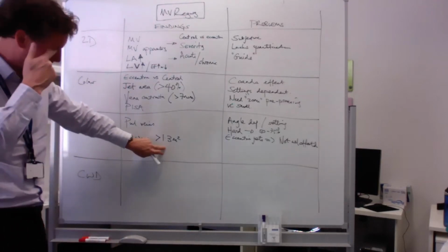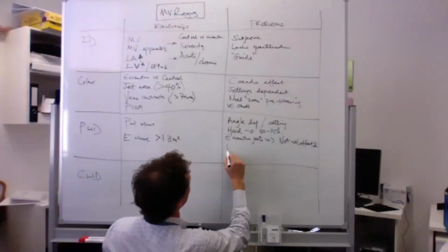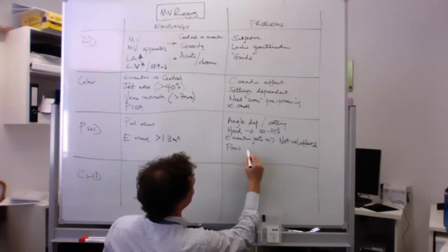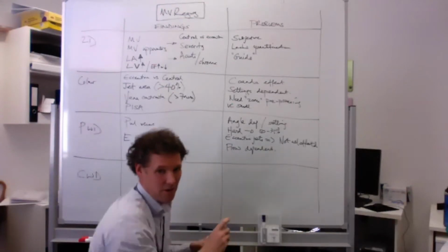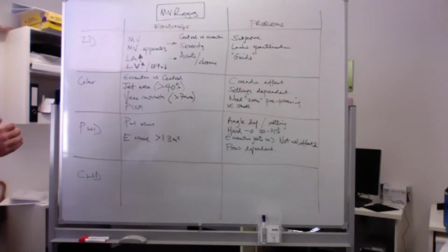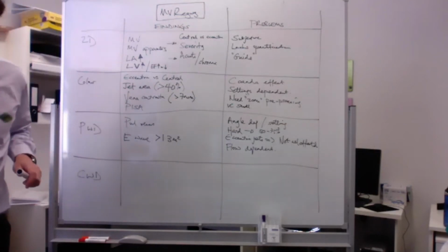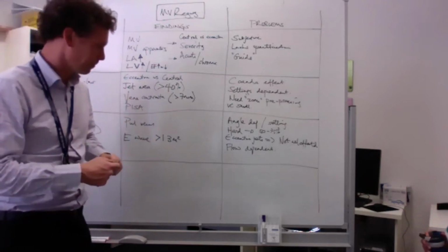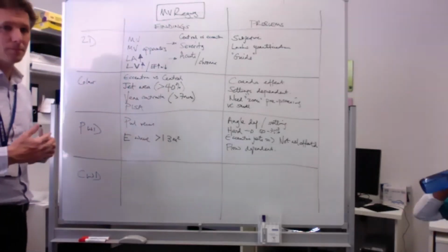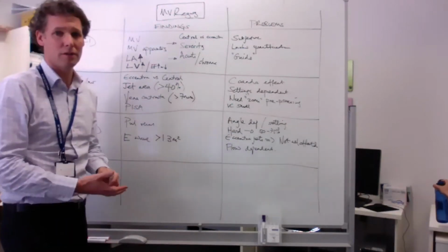What are the problems with that? Well, there are other causes of peaked E velocities, such as diastolic dysfunction or restrictive pathology. It is also subject to volume. It's flow dependent. Flow dependent, yeah. Nice, excellent.